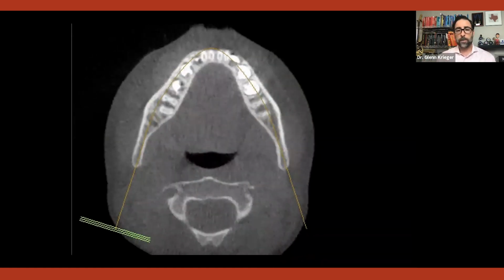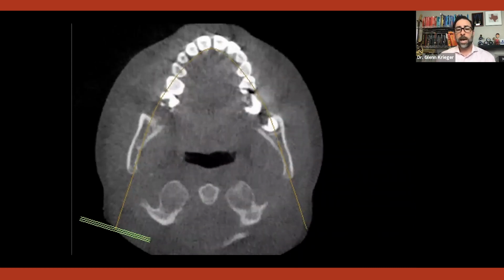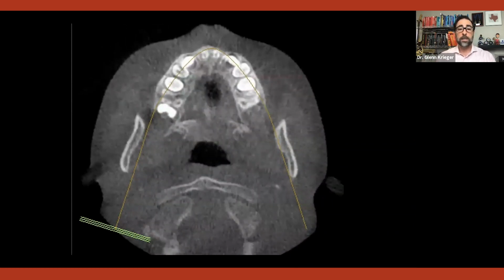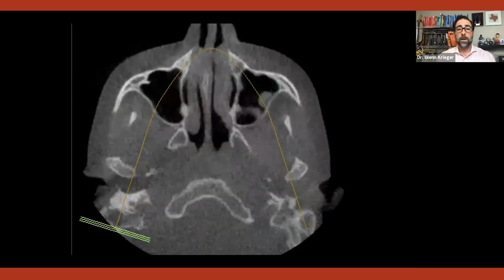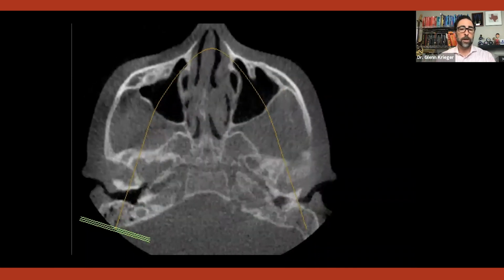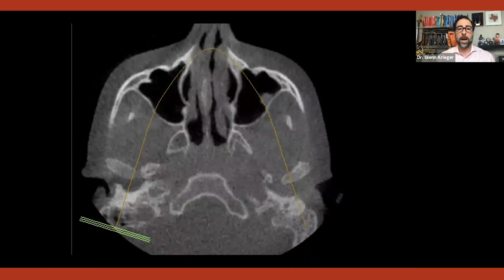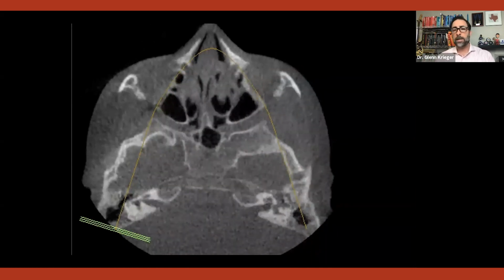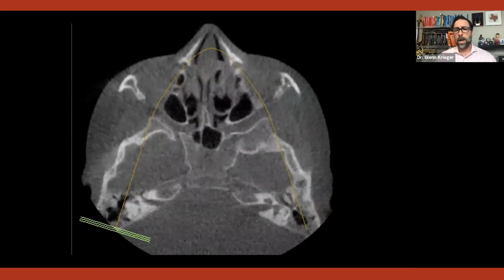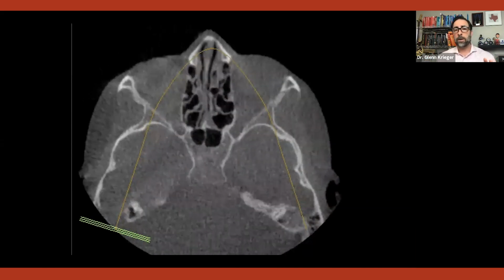If we're going to look at him from an axial perspective, and we want to look up, if you will, at his teeth, at his joints, at his nasal floor, look at that nasal area now. Look at that septum and look at his turbinates. Right? We think of airway, and everybody always talks about airway, airway, airway. Oh, expand, expand. You have to give this appliance. I am an interdisciplinary airway guy.